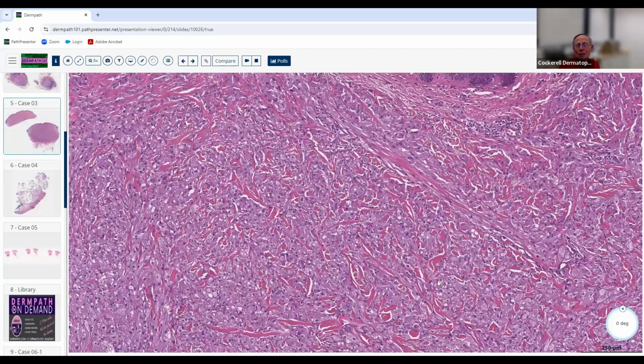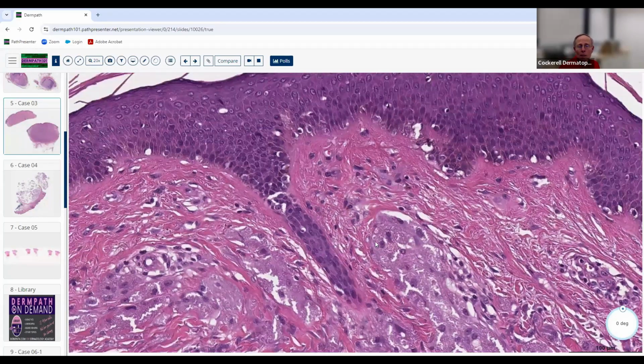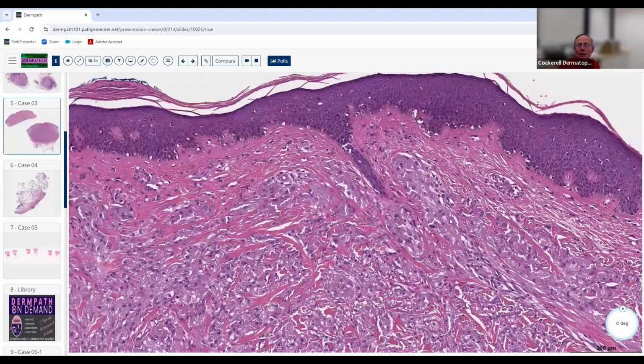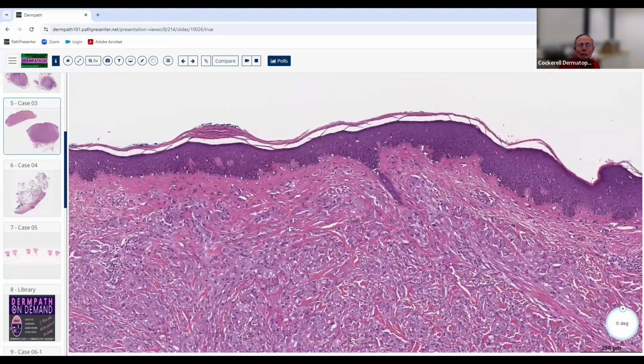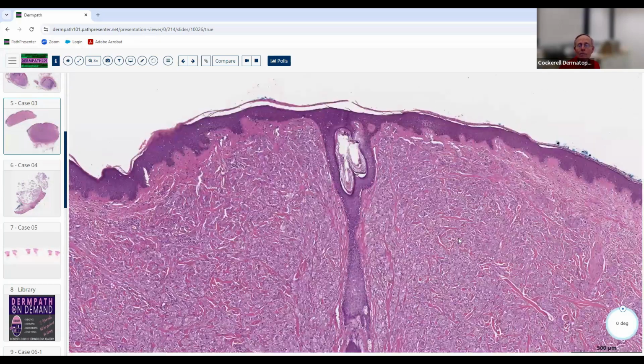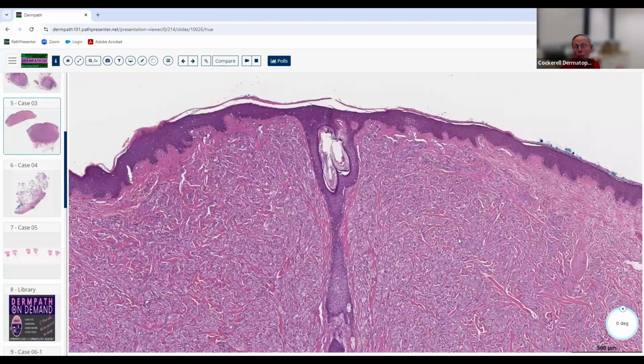Years ago, we used to think this was a muscle lesion. It used to be called granular cell myoblastoma because they look like muscle cells here. And what's another location that we see these very commonly? This one isn't that location here, but what's a common location where we see this lesion? You can see it on the tongue. Yeah, the tongue. And that's why years ago they used to think it was a myoblastoma, because obviously the tongue's got a lot of muscle in there, and it's often seen in dark-skinned patients, African Americans, for example. It's a very common lesion on the tongue in that setting.